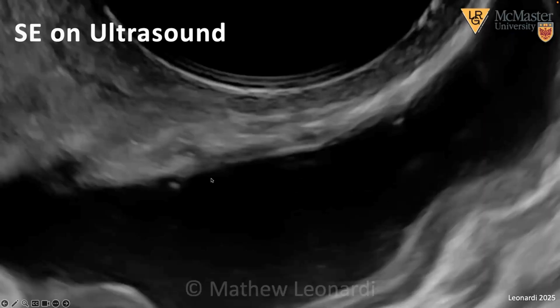In this particular case, we have multiple hyperechoic foci and a hypoechoic irregularity between the two. All of these are superficial endometriosis. Now, I'm not suggesting that by any means tomorrow anybody is going to go off, but once you start to do endometriosis ultrasound, in many cases, these actually do start to jump out at you. And once you start to systematically assess them, it is possible to be accurate in your assessment of them.